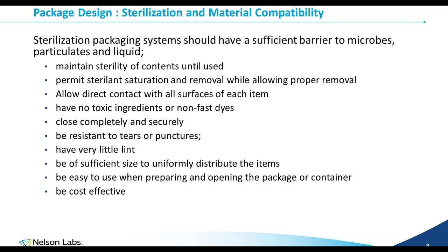The packaging has to allow for the sterilant, for example, ethylene oxide, to be able to penetrate and also be properly removed. The packaging should allow direct contact with all surfaces of the product. And obviously, it cannot have any toxic ingredients or non-fast dyes. It has to close completely and securely. So if it's a pouch, it has to be completely sealed. It has to be resistant to tear and punctures during the shipping and distribution environment.